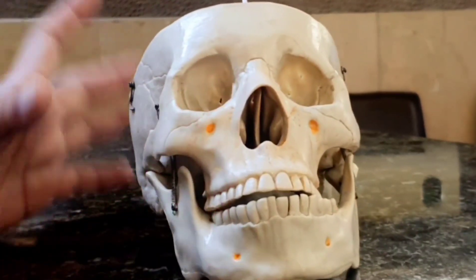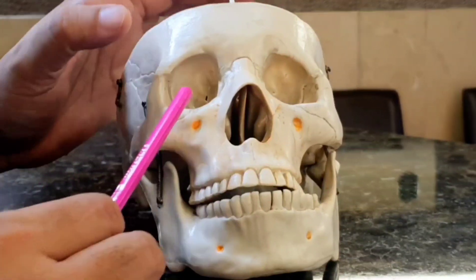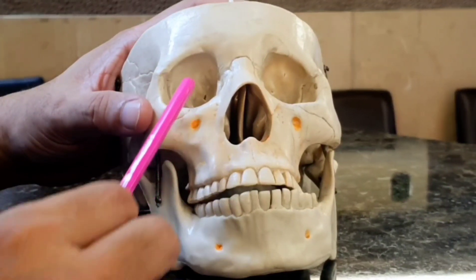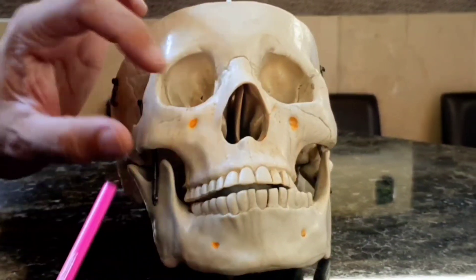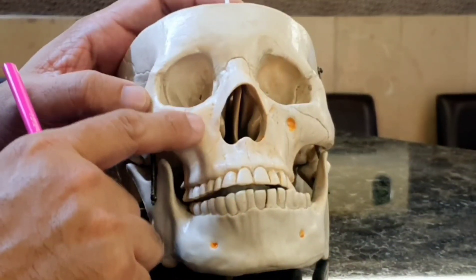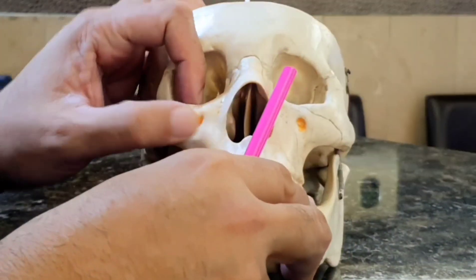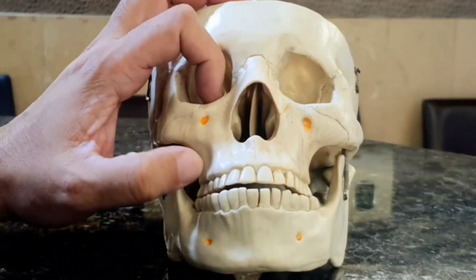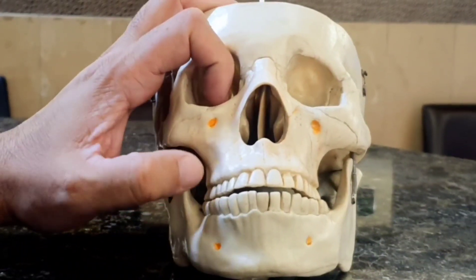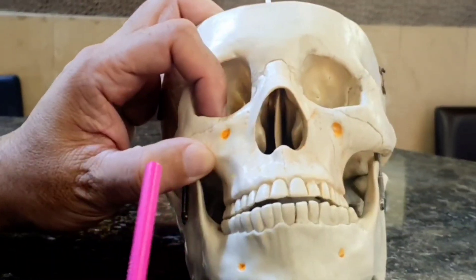We're going to start out with two simple ones. Number one is infraorbital. The infraorbital foramen is literally below the eye, below the socket. You can palpate it outside by moving your finger up and down and sideways. Once you find it, you know where it is. Then inside the mouth, you put your thumb inside, lift up the soft tissue, and rest it on the zygomatic arch. You'll be able to see it directly.